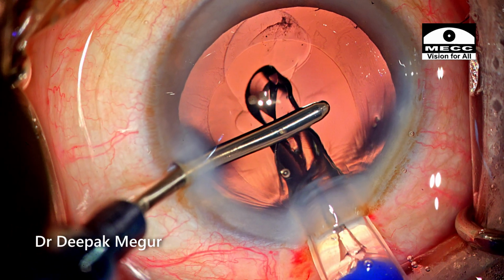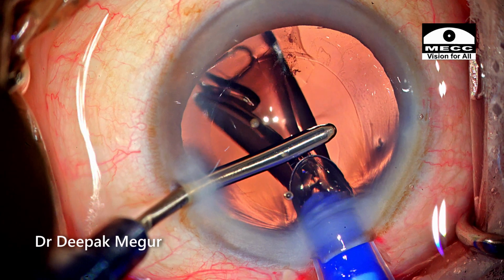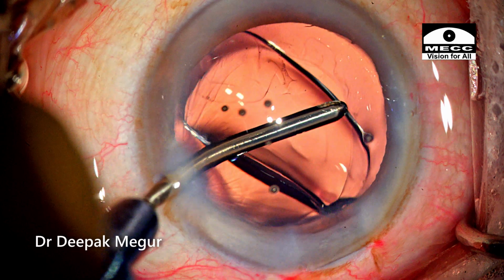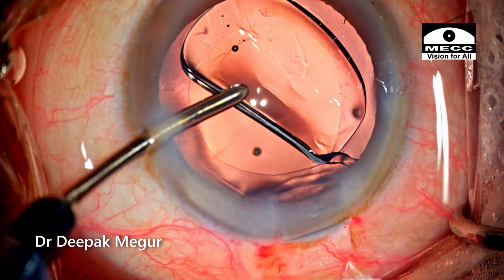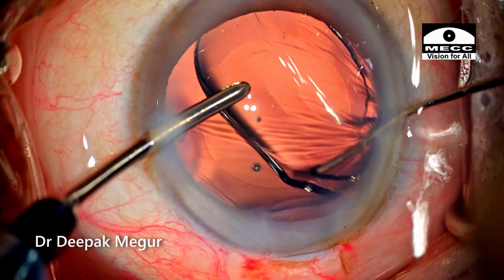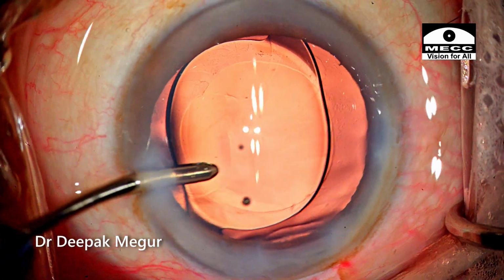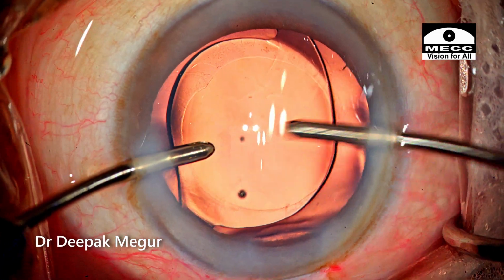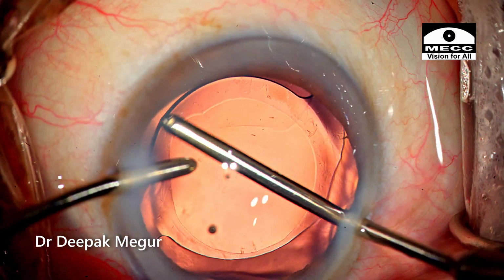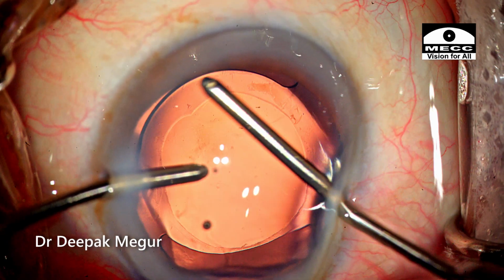I'm supporting the irrigation device above the lens so that it doesn't come out of the bag. So the distal haptic and the optic have all been inserted into the bag. The trailing haptic is then dialed into the capsular bag. I'm just trying to ensure that the lens is well centered, and remove a last bit of cortex and polish the anterior capsule there.